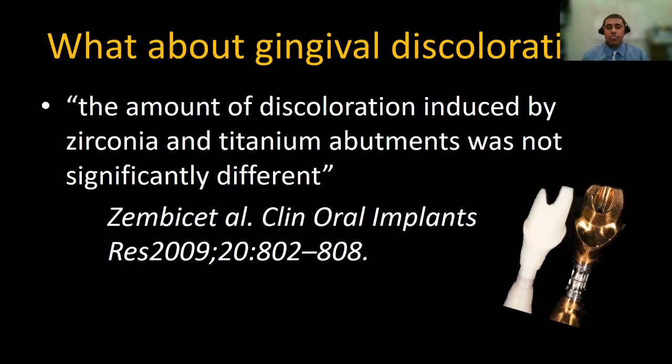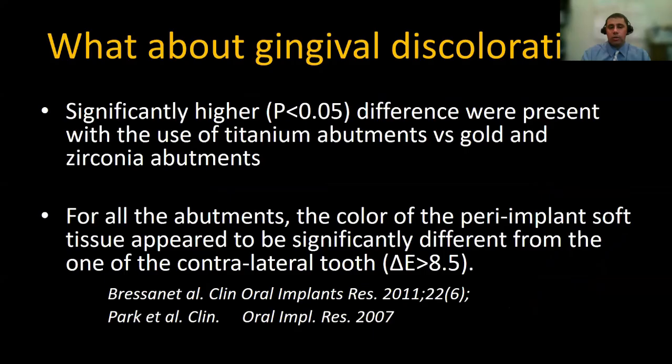So if a titanium abutment is the one to be utilized, probably plating it with a golden color results in a much better outcome and much less reflection of that grayish color through the transmucosal area.